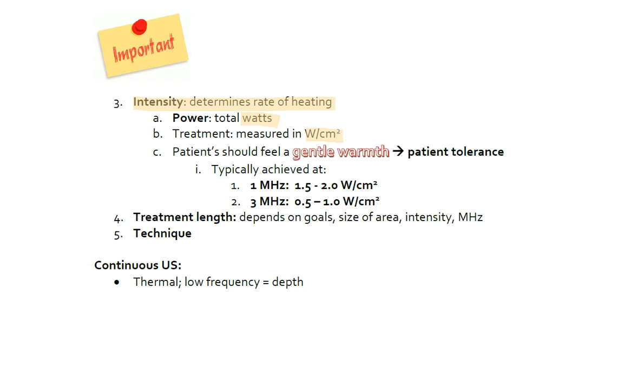If you are going for the goal of thermal effects, very important, you want to go to the patient's perception of a gentle warmth, and ultimately it's important to test sensation before to make sure they can sense what a gentle warmth is, but this will determine if you're in that thermal range or not.